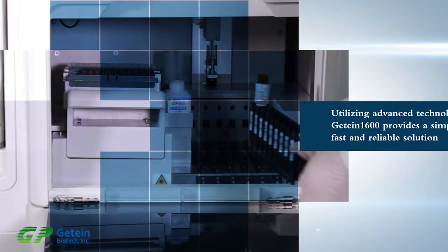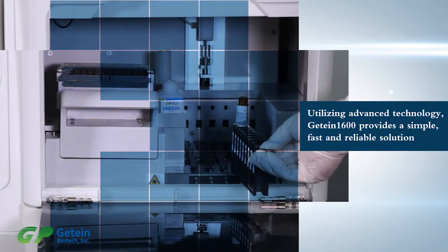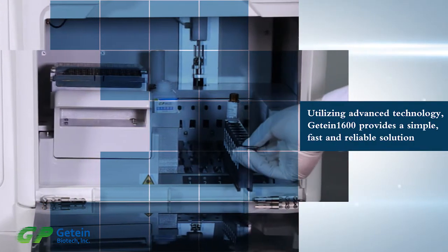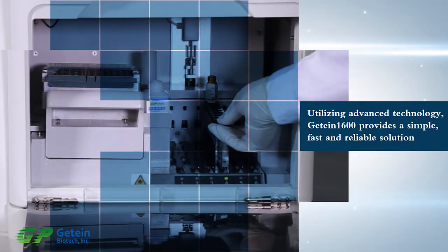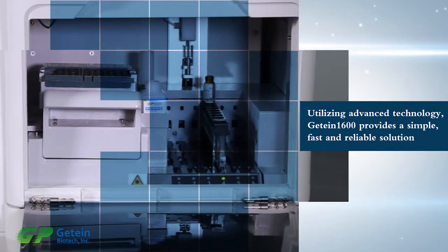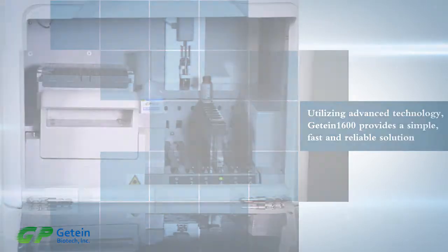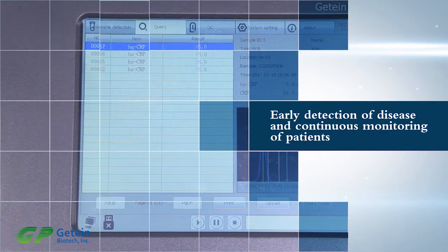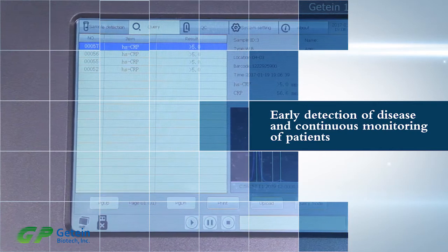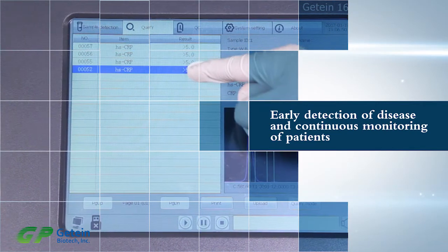Utilizing advanced technology, Getein1600 provides a simple, fast, and reliable solution to early detection of disease and continuous monitoring of patients.